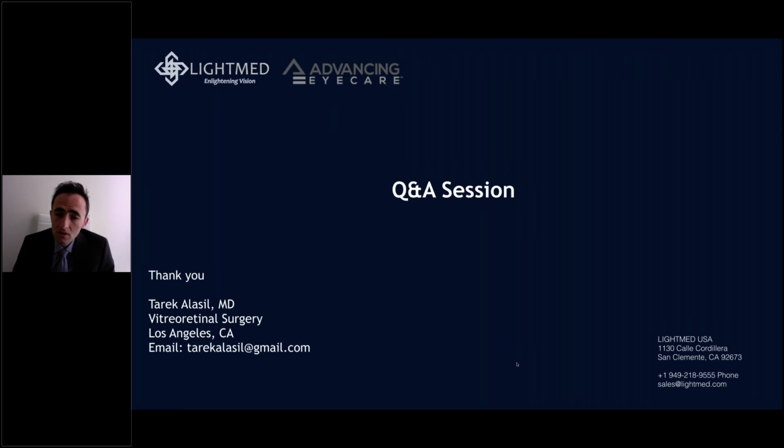I've been also using the green laser on the TruScan machine that I have. I would say green laser can be a comparable choice or even better when you're treating the periphery of the retina. Because when you're treating the periphery of the retina, even if you cause destruction of the RPE or the choroid, you actually want to create some scarring when you're doing, for example, laser retinopexy. You have a retinal break and you want to create a barricade of scarring around the break so fluid cannot go through the break and cause a retinal detachment.